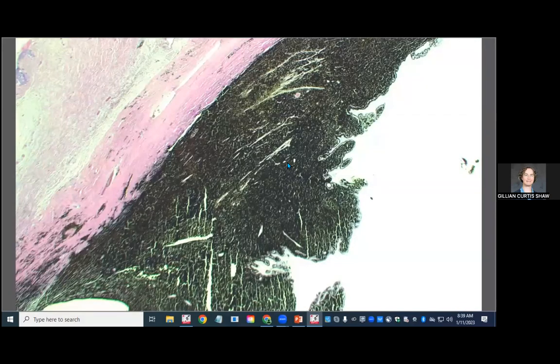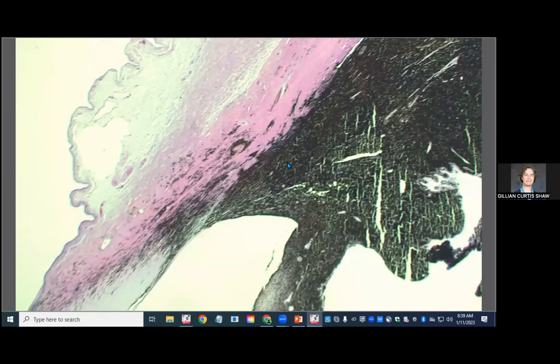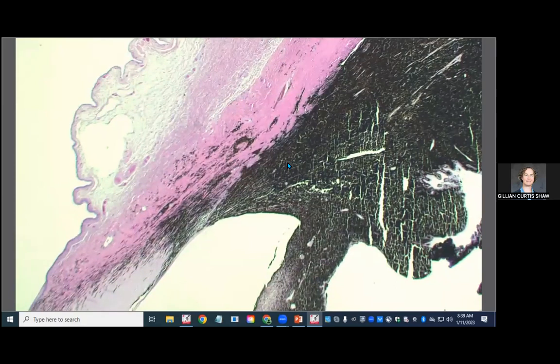In these cases, we have to decide whether the pigmented lesion that we're seeing in the uvea is neoplasia, i.e. some sort of melanocytic tumor, versus uveal melanosis, which is a non-neoplastic proliferation of melanocytic cells in the uvea that often causes distortion, i.e. expansion, and often also fills up and occludes the ciliary cleft and trabecular meshwork, and therefore decreases aqueous humor outflow and leads to glaucoma.